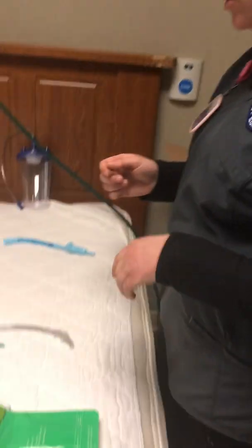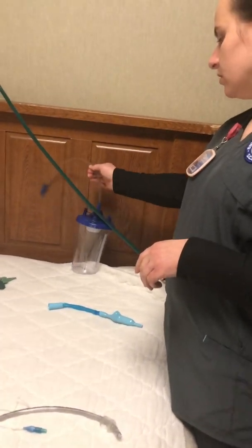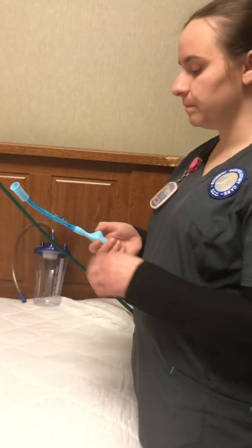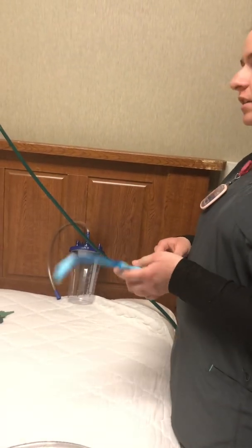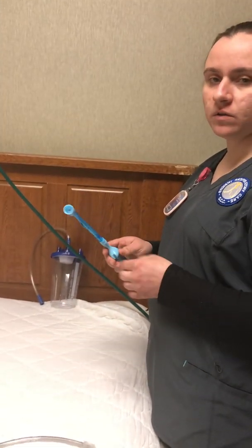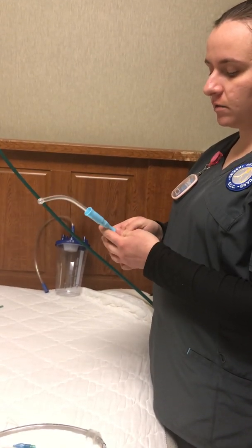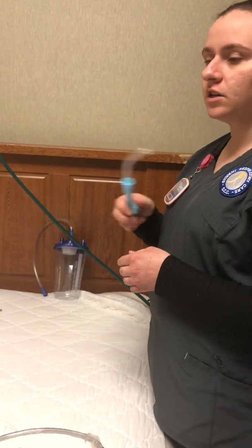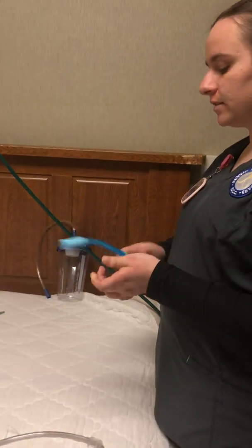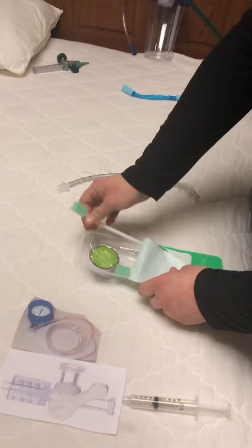So when I'm ready, I'm always going to do my oral care first. So I'm going to get my suction ready to go. I'm going to hook this up to my suction, and I'm also going to have an extra tubing and hook it up to my Yankauer. And then I'm going to set it to -100, -120 for the patient. So always before I do the oral care, I'm going to suction them out. I'm going to put the protective sheath down, and I'm going to turn on the suction. I'm going to suction the side of the cheeks, the back of the mouth, without initiating that gag reflex. And then I'm going to shut this off, make sure it's off, and then I'm going to go ahead and get their oral care ready.